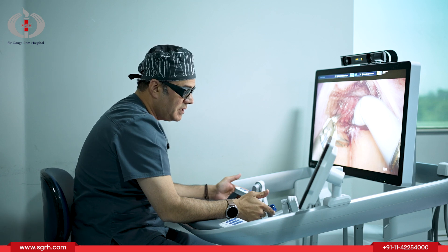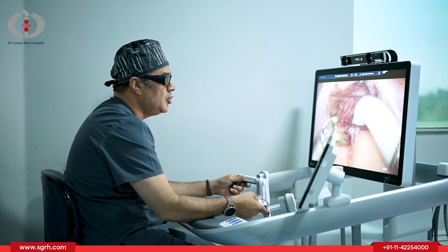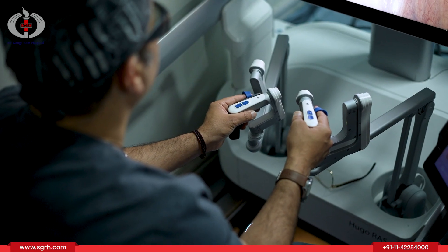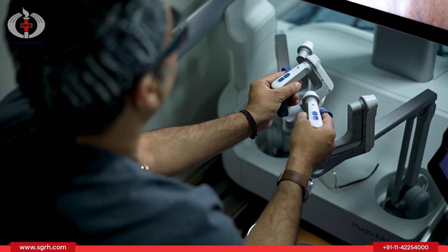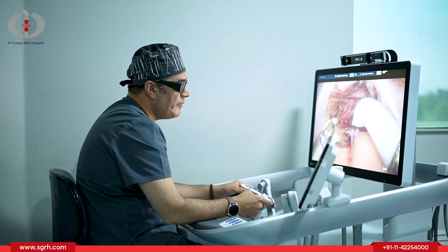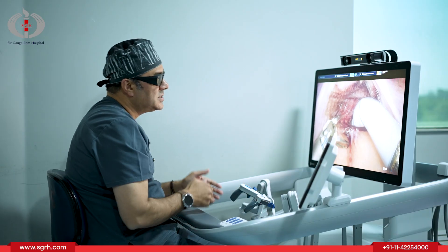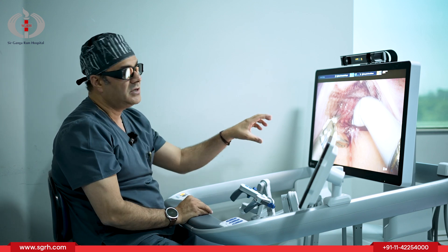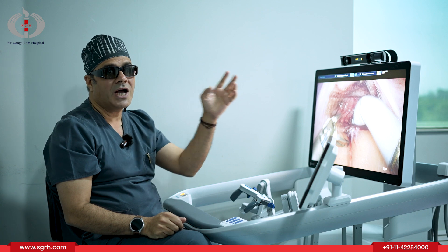The advantage of these movements is that I can move my fingers any way I want. I can stop my movements, I can control my movements, and I can control three instruments at one time. I can also control all the movements of my currents and the energy sources by my foot pedal. This console provides me the inside vision of the patient's body through the robotic arms.